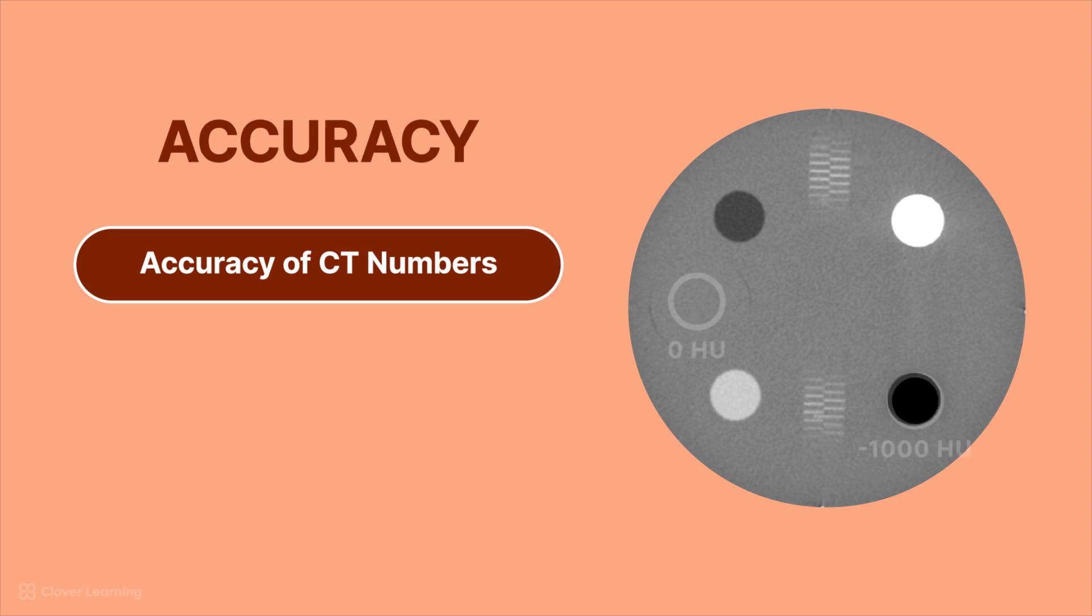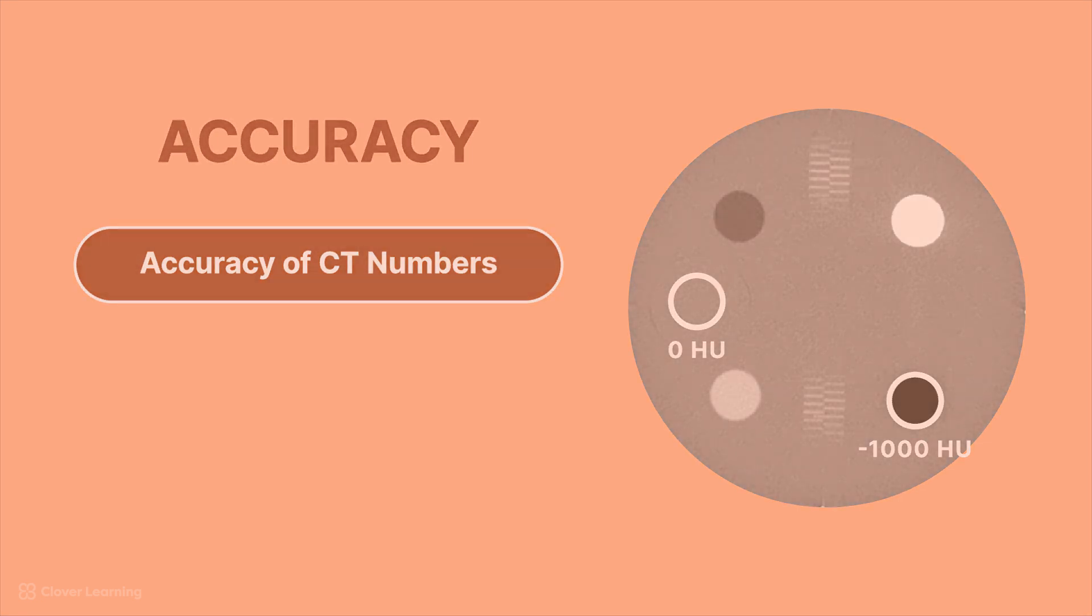If we place an ROI over the area representing air, we should get an accurate CT number of about negative 1000 Hounsfield units. But if we place the ROI over the area representing the consistency of water, we should receive an average Hounsfield unit of something very close to zero. Whether or not these numbers represent the expected CT numbers is the accuracy of the CT system.